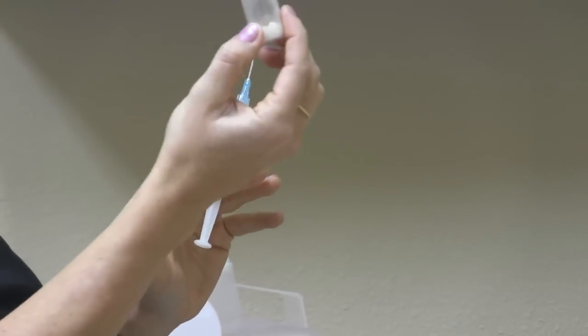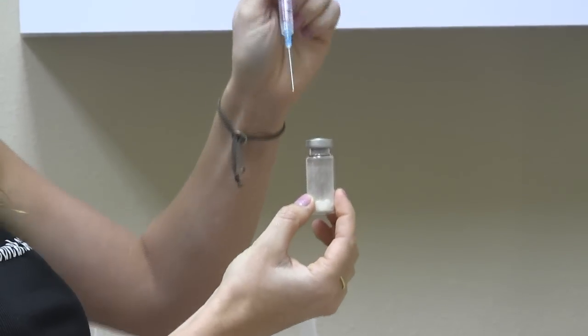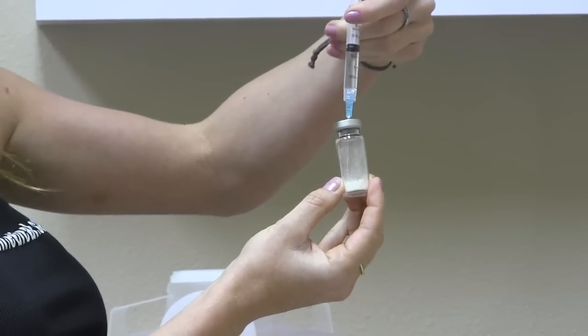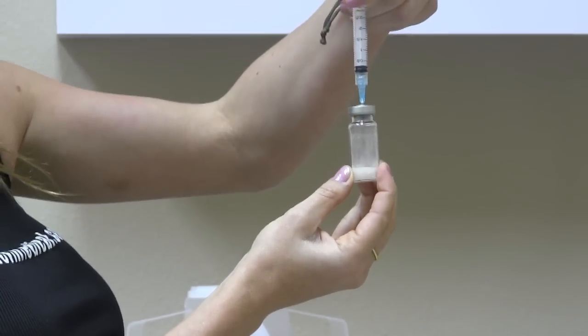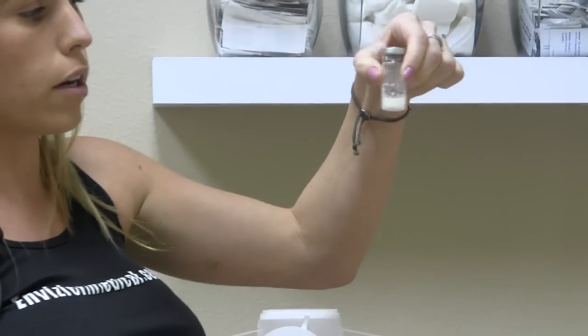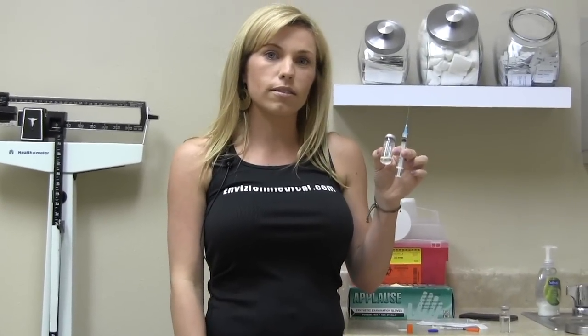Now I have my lyophilized powder. I'm going to take the two cc's of water and push it down into the powder. You don't want to shake these — just swirl them a little bit until the powder is dissolved. You have now seen the proper way to reconstitute medications. Thank you.